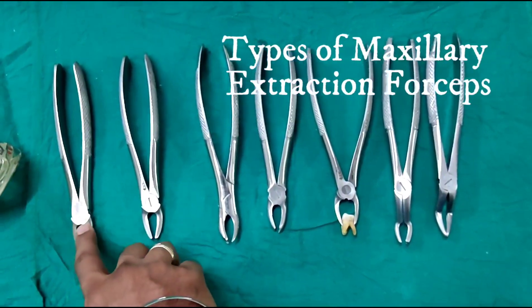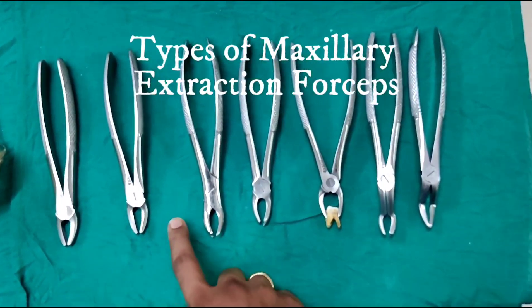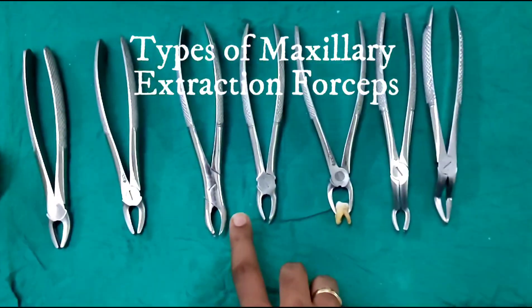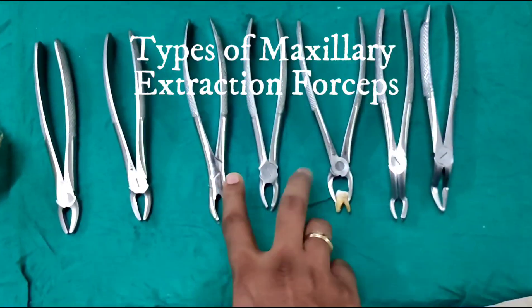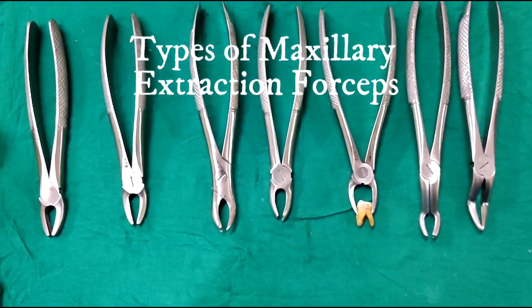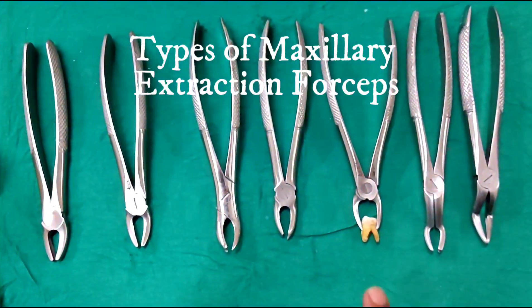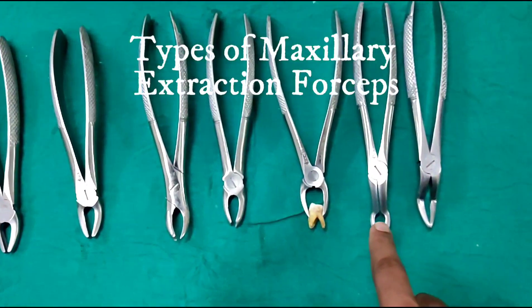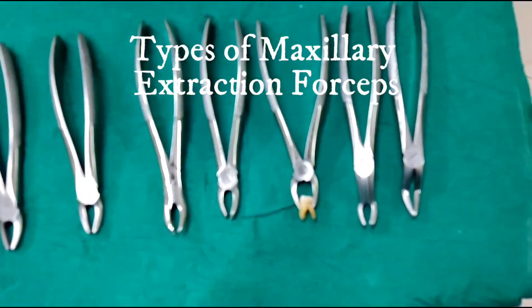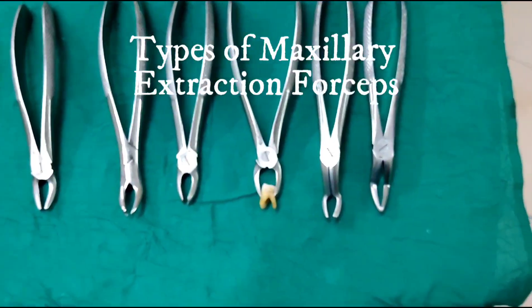One is the anterior extraction forceps or the incisors forceps. The second one is the premolar extraction forceps. Third one is the molar extraction forceps — there are different types depending on the shape of the beak, which I will explain in detail later. This one is the third molar forceps, designed to give access to the third molar. And this is the root tip forceps, or root forceps.